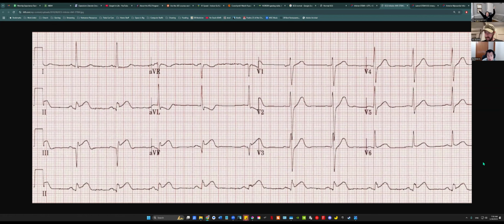All right, good. Let's do this in parts. Very slight depressions, possibly in V5 and V6. Ian, sell me on the depressions. Convince me why those are depressions in the aVL. So you're looking at your baseline, and then your ST segment is lower than your baseline after your QRS. That's why I call those depressions.